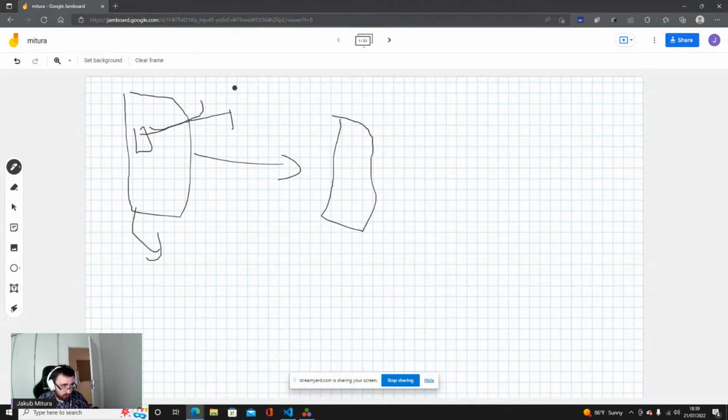So for example, in the case of the lungs, when we just zoom into a very particular spot, rotations usually are very good. But if we are not zooming in and we are looking at the whole lungs, rotation would lose some information. This is quite a deep topic that needs understanding. There are a lot of different augmentations depending on the case and on the invariances that we want to achieve.